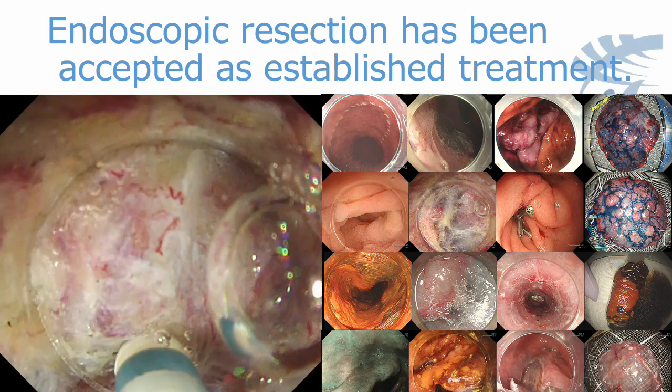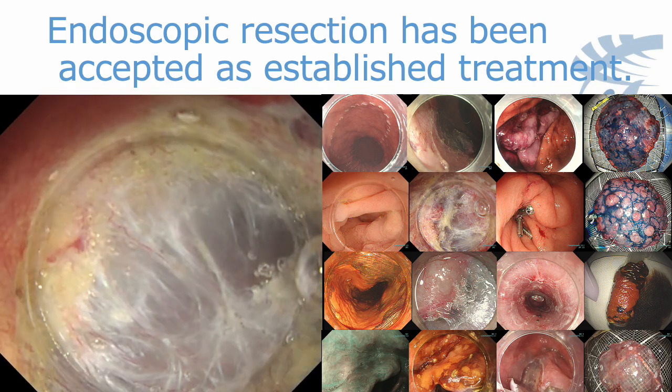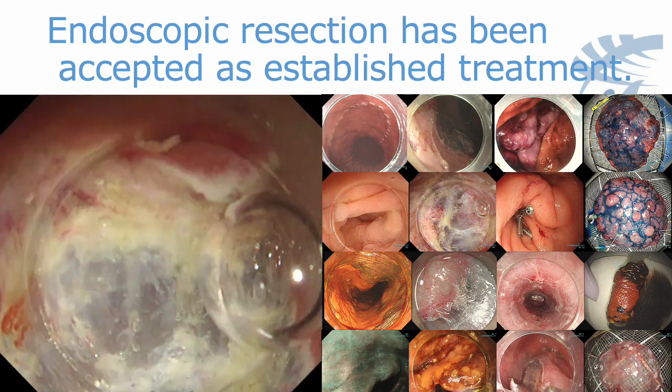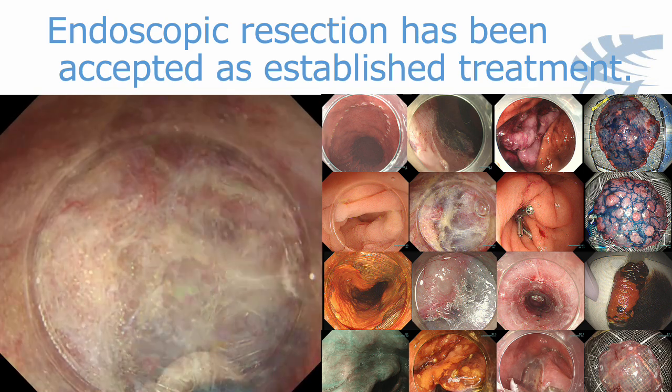The movie on the left shows ESD of a large lesion that is mostly hidden in the appendix. Recently, the popular underwater ESD has made it possible to resect lesions that were not resectable in the past.